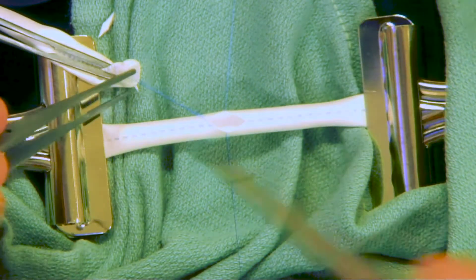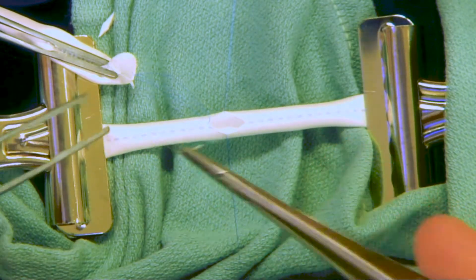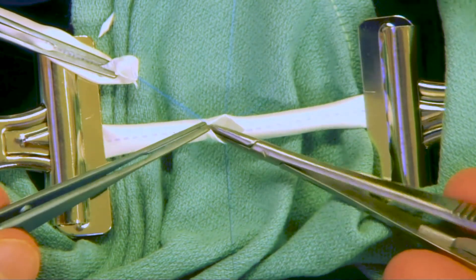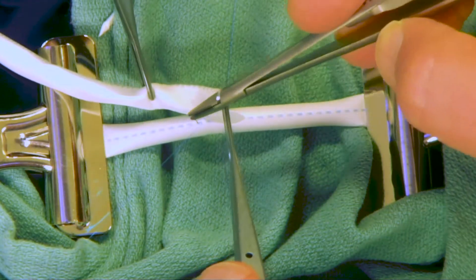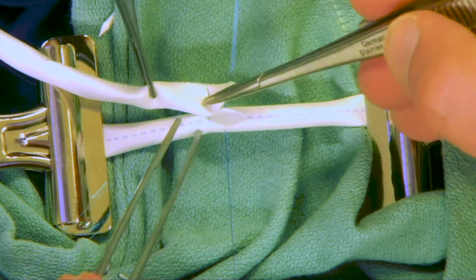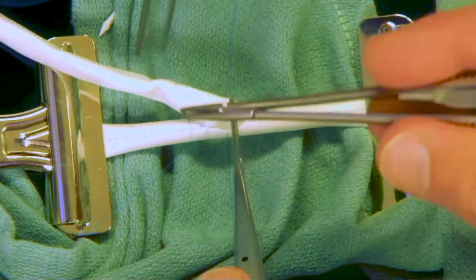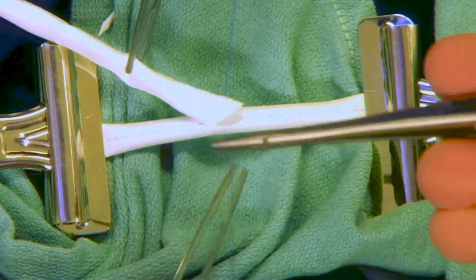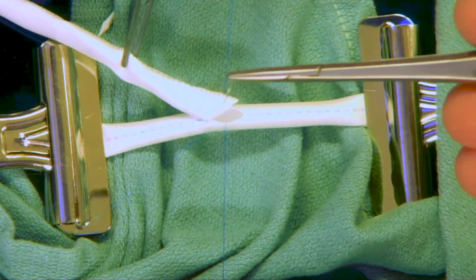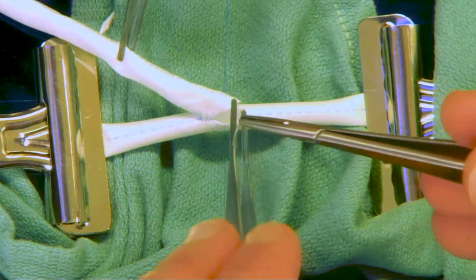After placing the first three sutures to get us around the corner of the heel, we'll bring the blood vessels down together and secure them with following. Note that when using an assistant, they can hold opposite the heel to provide good exposure such that you can maneuver at the front end of the graft as you suture them together. It's important to come at right angles to the vessel as you're suturing it and try to suture evenly with spacing.